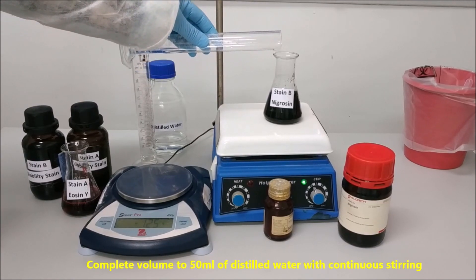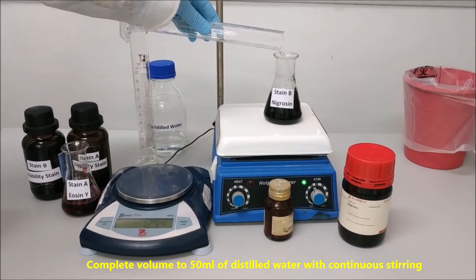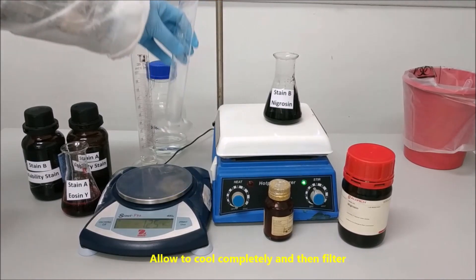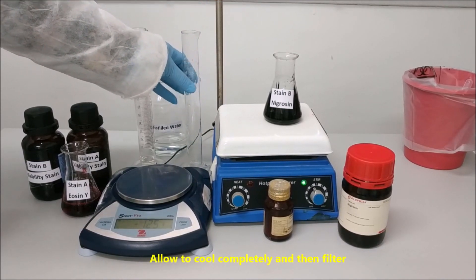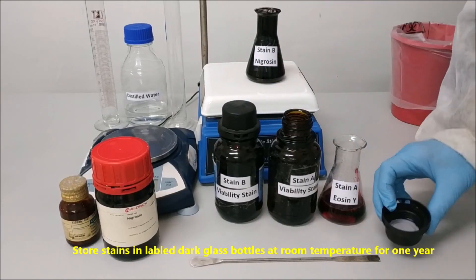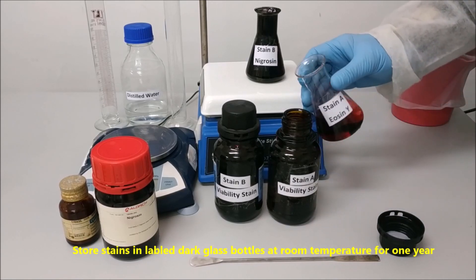Complete the volume to 50 ml of distilled water with continuous stirring. Allow to cool completely and then filter. Store stains in labeled dark glass bottles at room temperature for one year.